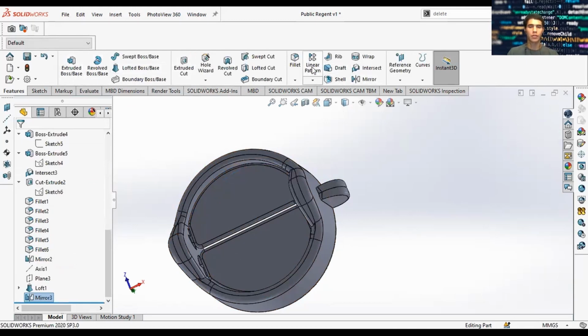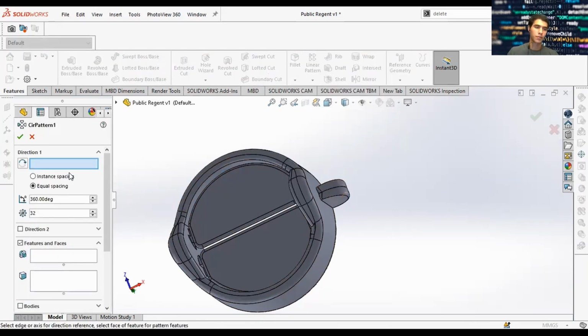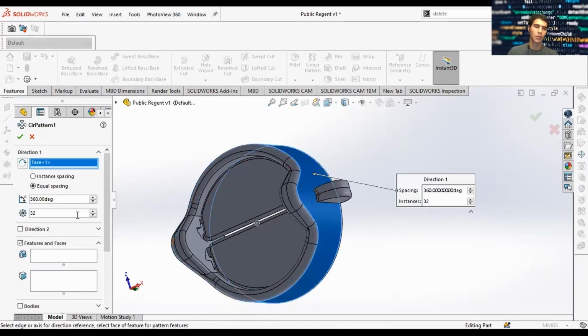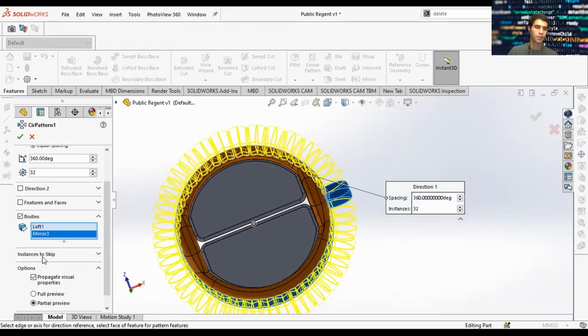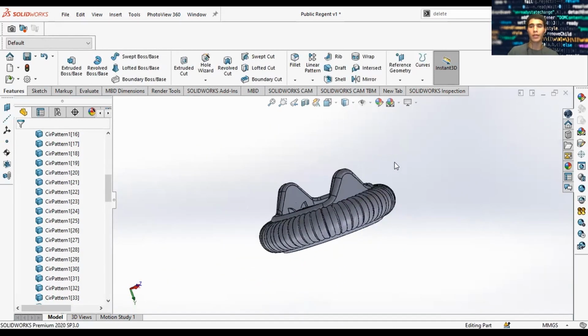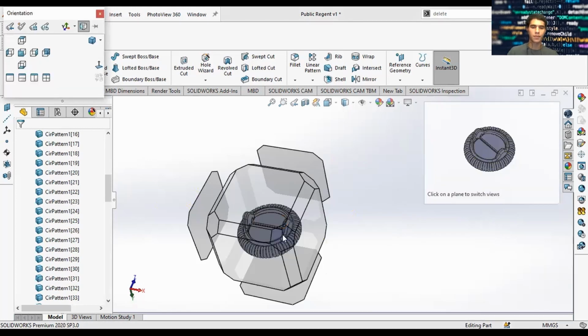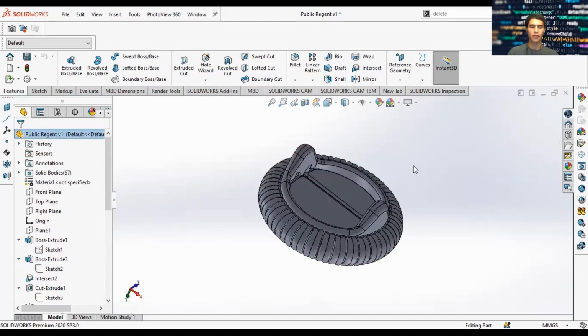So now let's go revolve this loft around. And we do that by using a circular pattern. We choose our direction that we want to revolve it. In this case, we want to make 32 equal instance spaces. And now it's more like a cuff. And so this cuff will be what's implanted onto the patient's heart tissue.